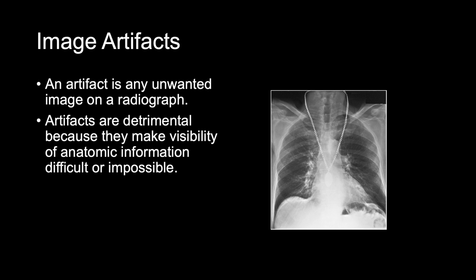So in this chest x-ray here, you see the necklace. That is an image artifact, and it is radiopaque. So if the patient did have a tumor or something else hiding behind this pendant on the necklace, we wouldn't be able to see it because this pendant is radiopaque, so it's blocking whatever's behind it.